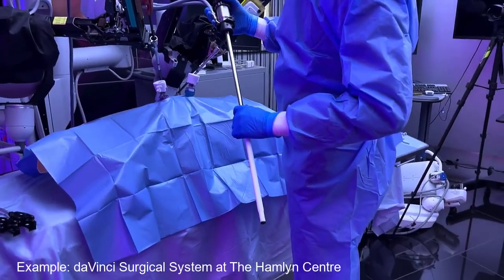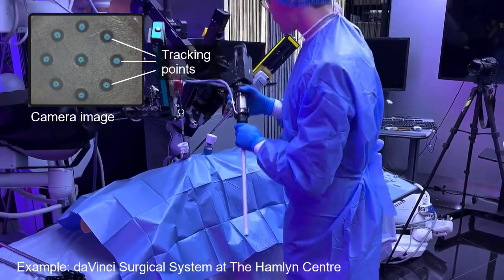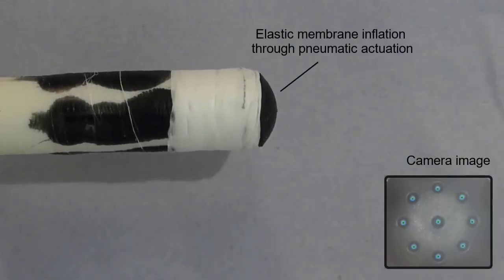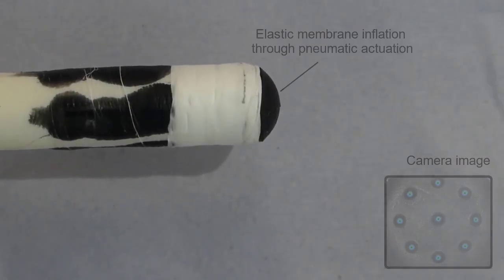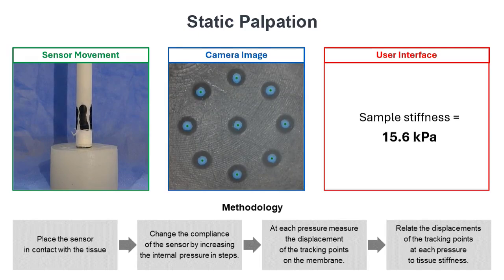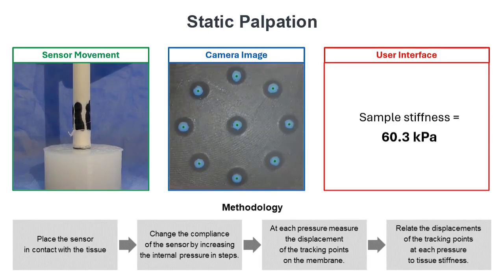The device can be put over a laparoscopic camera, which then monitors a pattern on the inside of the membrane. The compliance of the membrane can be adjusted by controlling the sensor's internal air pressure. The sensor can measure soft tissue stiffness during static palpation by adjusting its compliance to multiple values and measuring the membrane's response.